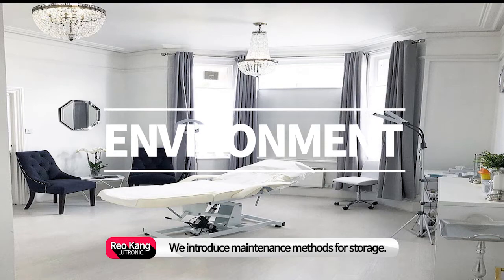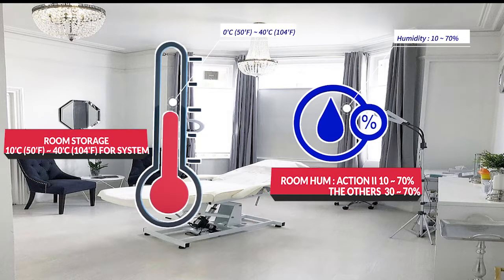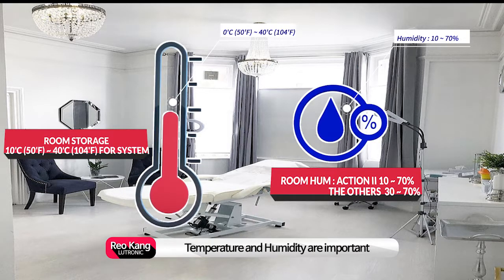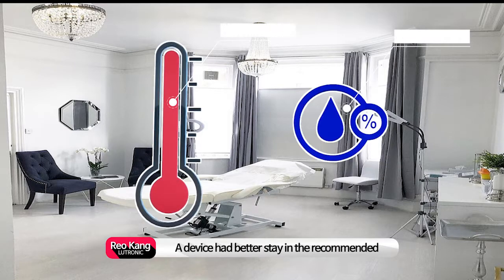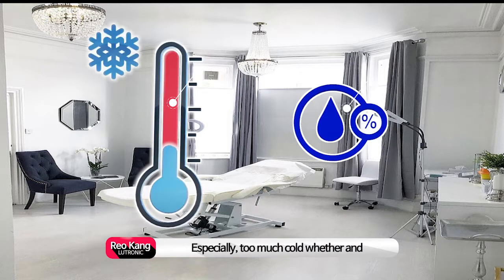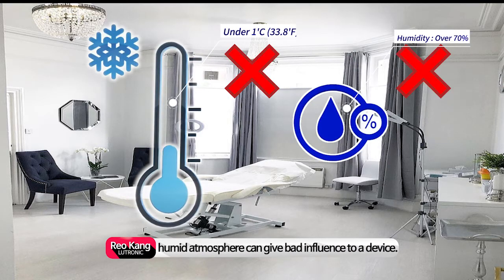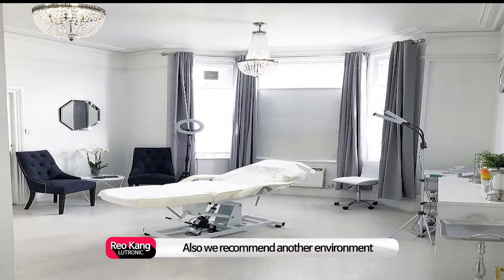We introduce maintenance methods for storage. Temperature and humidity are important factors for device control. A device had better stay in the recommended temperature and humidity for storage term, and especially too much cold weather and humid atmosphere can give bad influence to a device. We also recommend other environment requirements that should be satisfied.